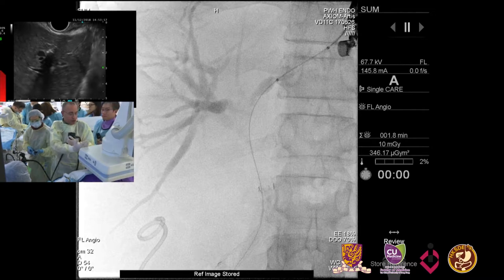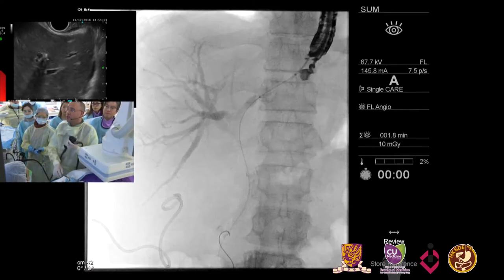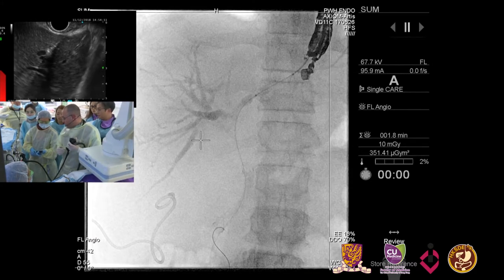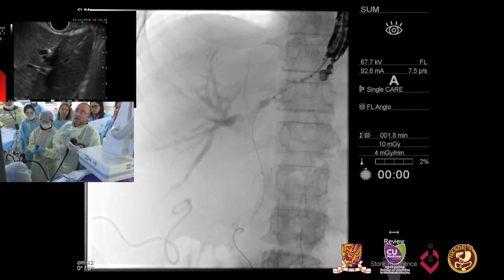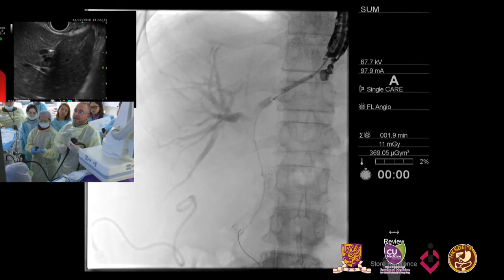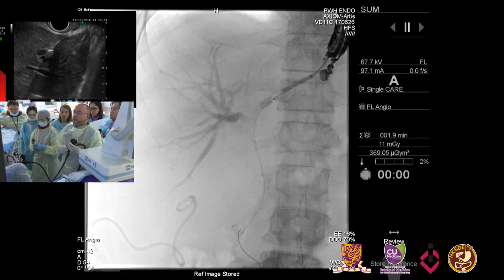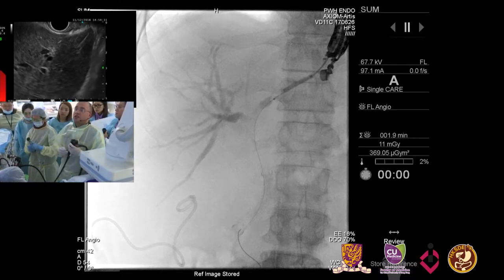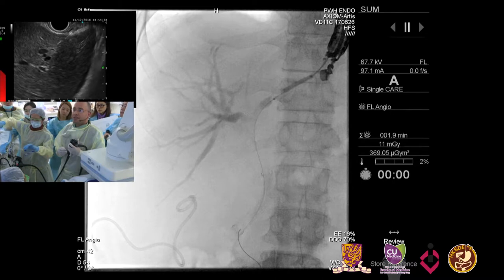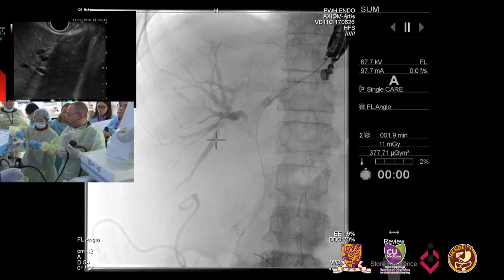Can we have a little bit of fluoroscopy towards our side so that we can see more scope? Okay, that's excellent. Okay, let's go to 4 millimeter, please. You have contrast in it? Okay. Dilate and deflate right away. So what's the difference between a 6 French cystotome and your Hurricane balloon? I'm just not using any cautery. That's basically it. I see. Okay, let's re-dilate, please. Dilate again.